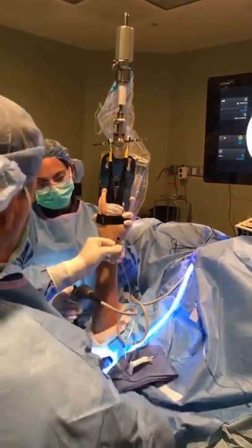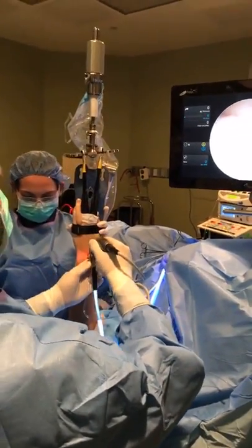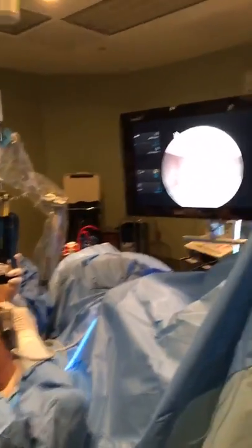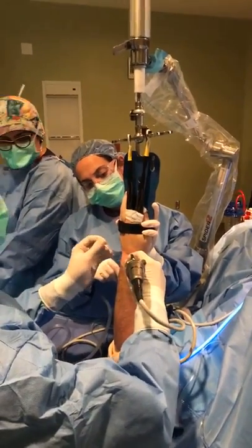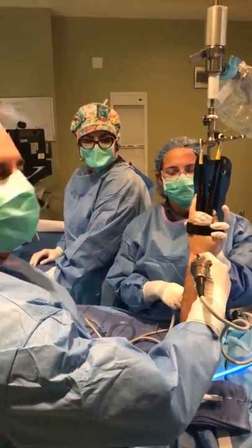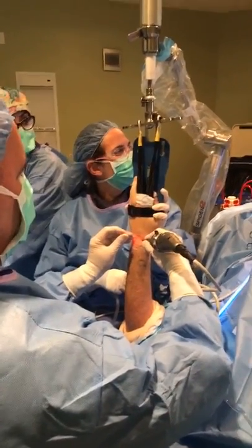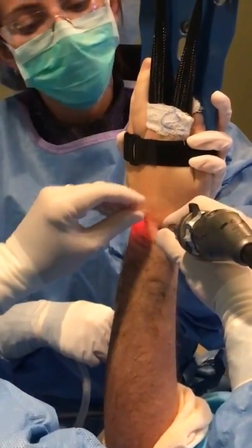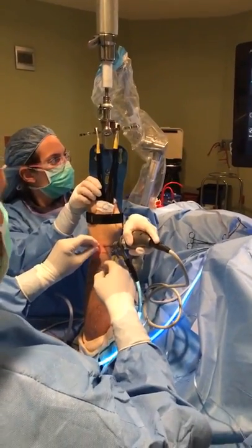Okay, so this is very small spaces. Right, but yeah, I'm definitely in a midcarpal joint. Okay, so this big bone is called the capitate. When I started lecturing in South America, I had to learn the anatomy, and they told me the capitate is called hueso grande. I said, okay, I got that. But this looks really good. This looks really pristine. He's in his 20s, right? In his late 20s. Yeah, so this is what you would expect. Now, this part of the wrist is inflamed as well, we'll see in a moment.